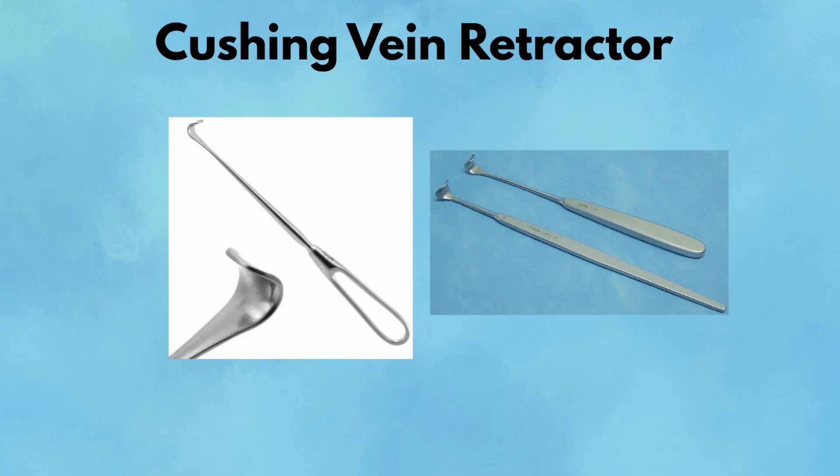Pearl: excellent when you need to expose a vein or artery in tight quarters without compromising its flow or structure. Pitfall: avoid applying pressure for extended periods — vein retractors are for light, temporary exposure only.